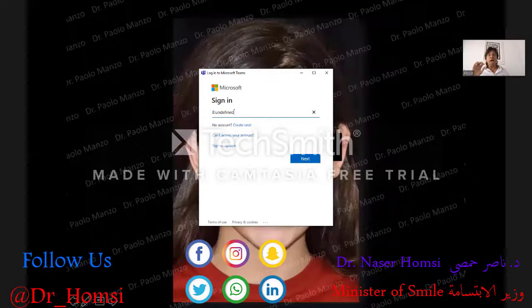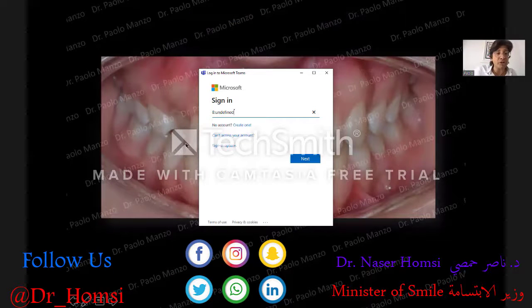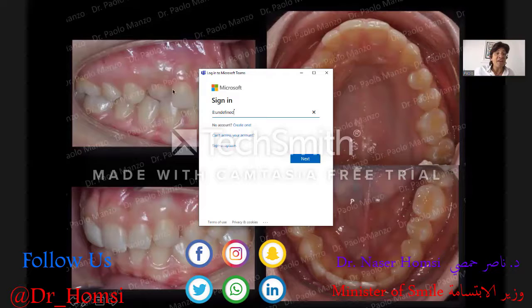Now, I want to go close to the end of the presentation, showing you something that for me is very interesting in my daily practice, because I started this kind of treatment with Sabrina some time ago, a couple of years ago, probably quite more. Sabrina is the sister of one of the doctors working with me. And Angelo, this doctor, told me, Paolo, Sabrina wants to show you something. She doesn't like to smile because she catches something like a black hole here, and the black hole is connected with the crossbite on the canine, which is very easy to correct.